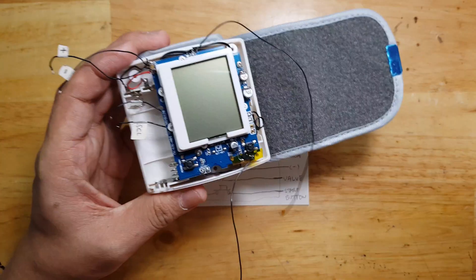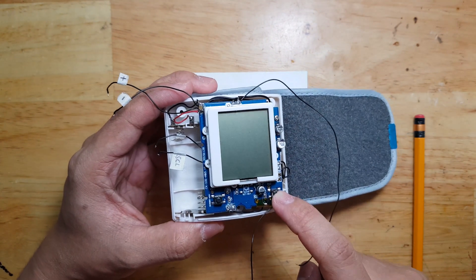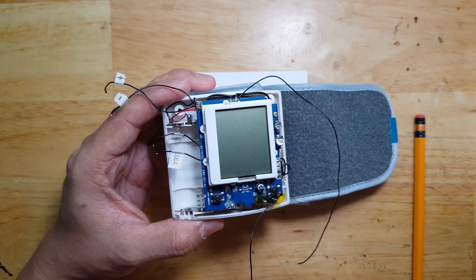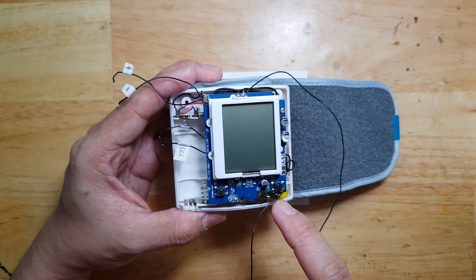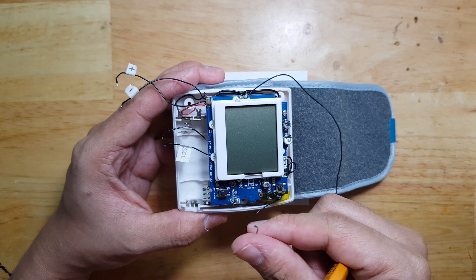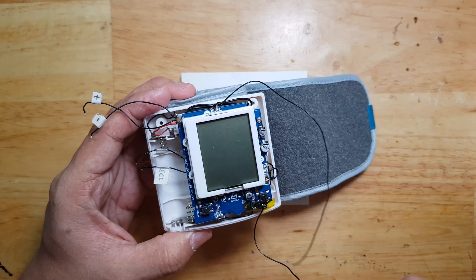The idea is this blood pressure monitor works when you press the start button. Without pressing it, you cannot start the machine. So the Arduino should be able to automate those processes on its own. That's why we put in a transistor, emulating that button. We can put this on an Arduino pin and that pin, once toggled, can control the on and off.